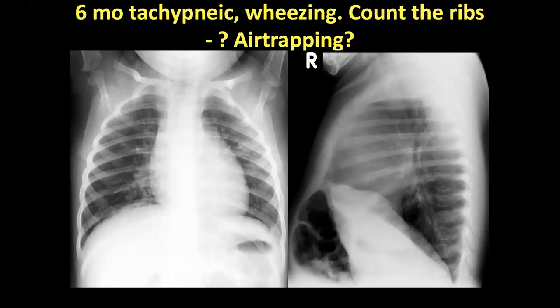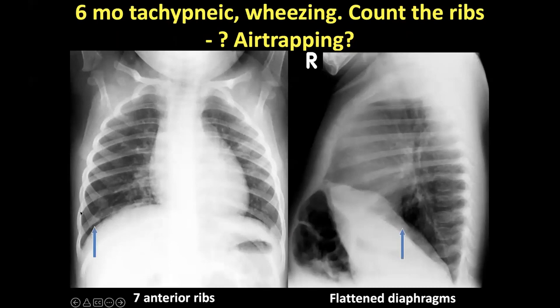If we do have a correctly positioned and well-inspired X-ray, when we see more than five anterior ribs — in this case seven — we can confidently say that there is air trapping, most commonly from peripheral airways obstruction in children. If you do have a lateral, that can be confirmed by looking at flattened diaphragms or increased retrosternal air.